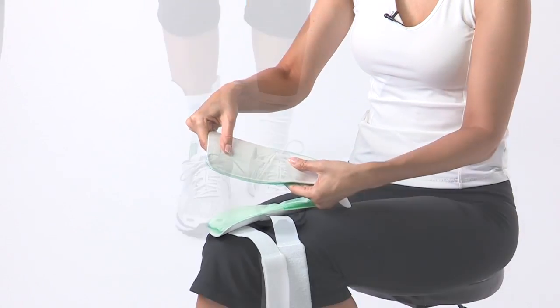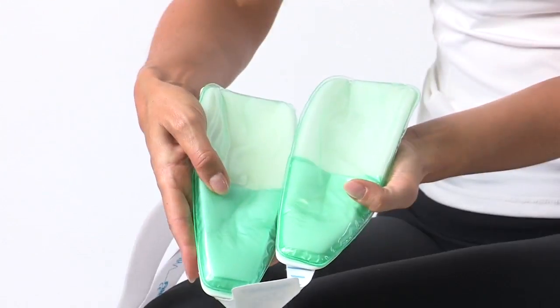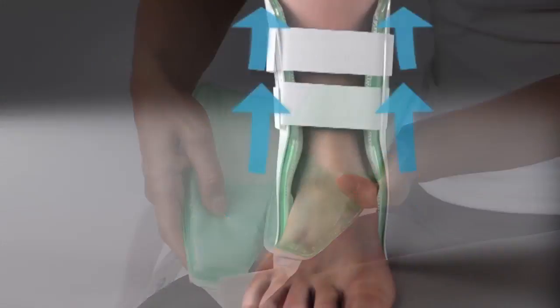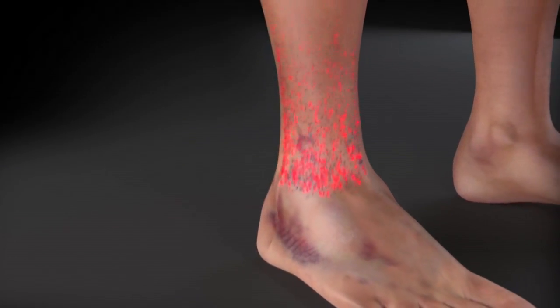Here's how it works. The semi-rigid anatomically designed shells provide support and help prevent rollover. The two pre-inflated air cells inside provide pulsating comfort as they work together to reduce swelling and increase circulation.